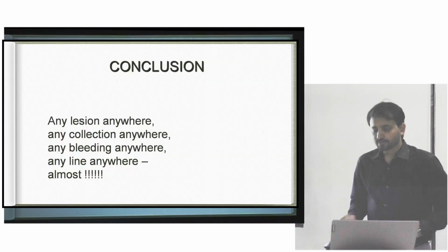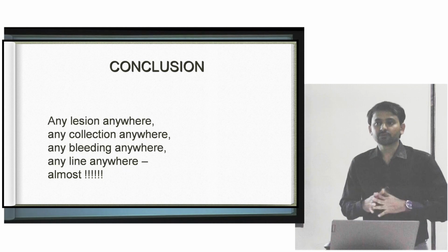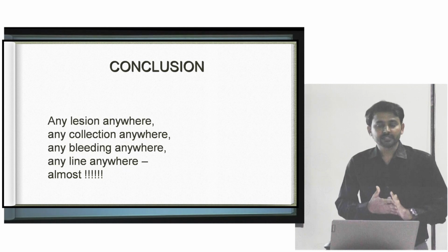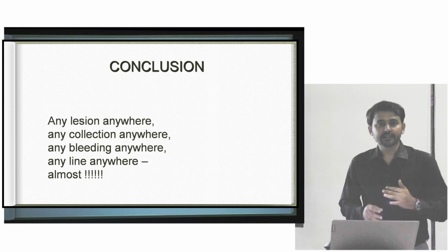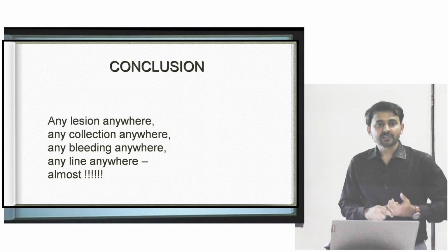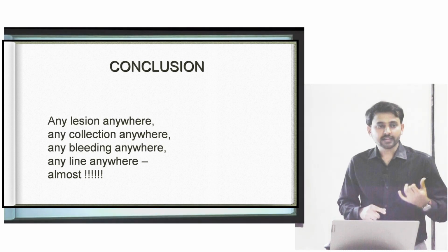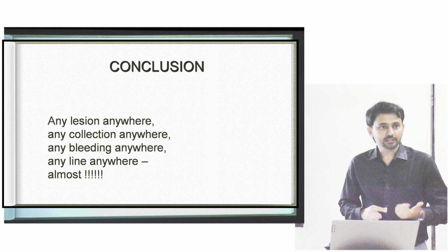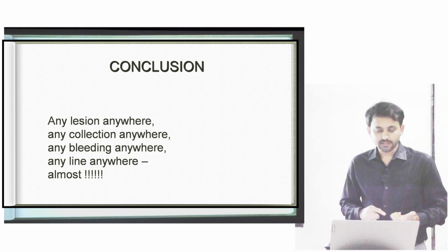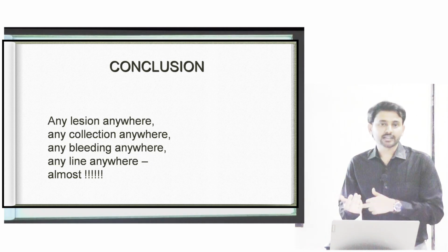So to conclude, as I already told you, 90% of the procedures are done under local anesthesia as daycare procedures, and the patient can go home the same day, either for diagnosis or for treatment, for any small targets or collections or bleeding, or lines like ports, PICC lines, Hickman lines.